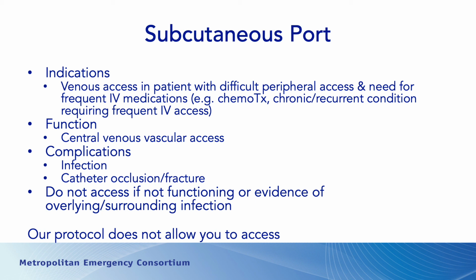If these devices are present, we currently do not have in our protocol that you can access them. It requires special training, special equipment. I know some of my agencies in the past have accessed these devices, and they did have the equipment and the training. It's just when we have 17 agencies and 500 providers, it's difficult to keep everybody up to speed on how to access these devices.